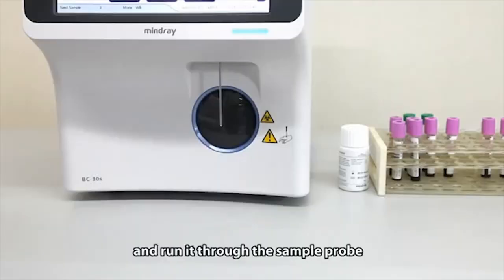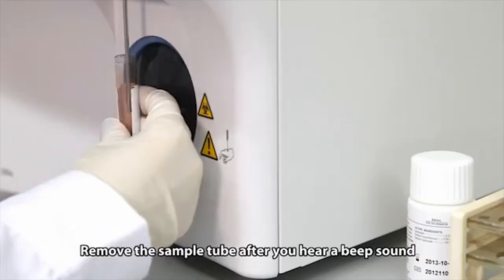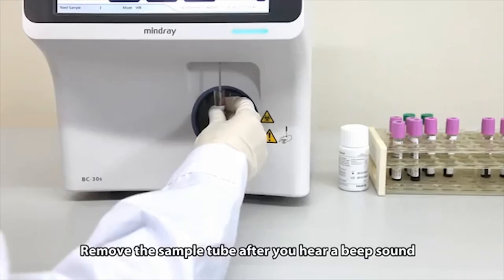Mix the sample well and run it through the sample probe. Remove the sample tube after you hear a beep sound.